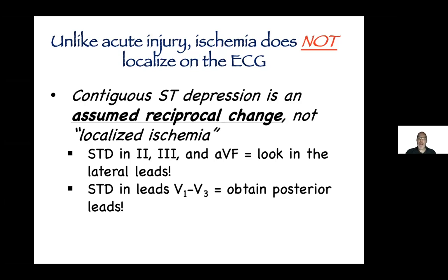So how did they figure that out? During cardiac stress testing. That's one of the things that your cardiologist does not want to see. When you start developing widespread or diffuse ST segment depressions, it's at that point they're usually going to say, okay, you can go ahead and stop. And oftentimes at that point, you're probably complaining of chest pain. So in that regard, the stress test and the 12 lead will show diffuse ST depression.